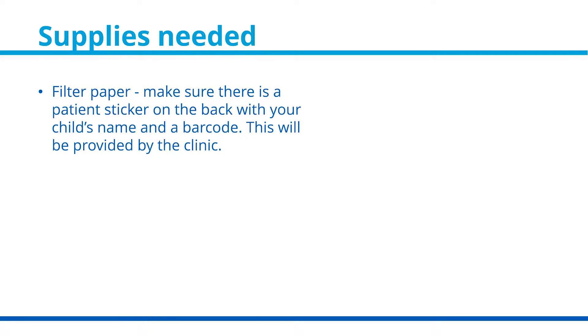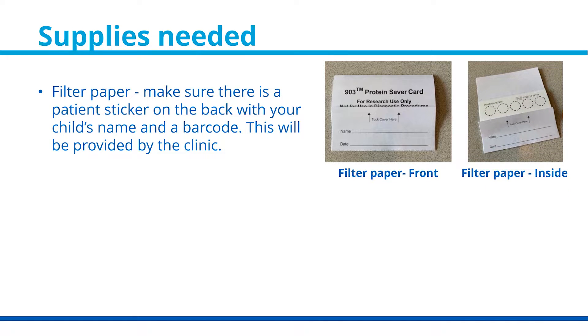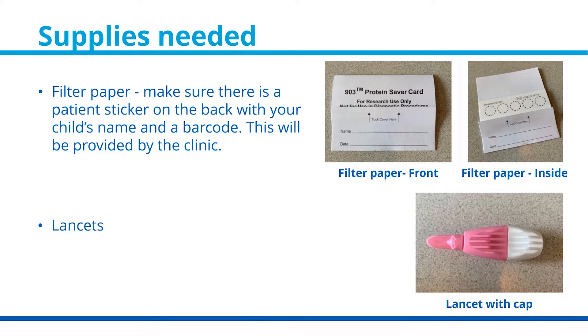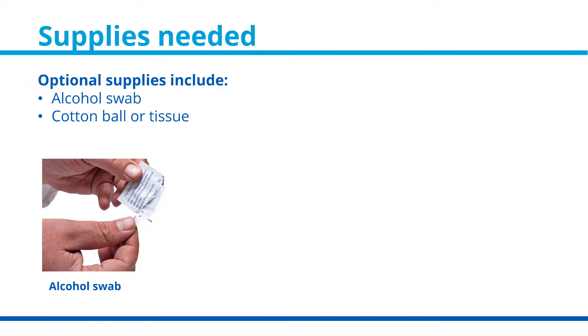The supplies you will need are a filtered paper card with a patient sticker on the back. This patient sticker will have your child's name and a barcode on it, and will be provided by the clinic. You will also need a lancet. Optional supplies include an alcohol swab, cotton balls, or tissue.